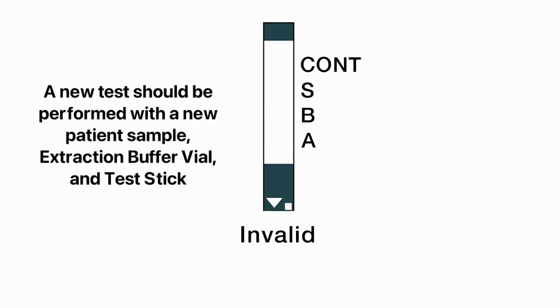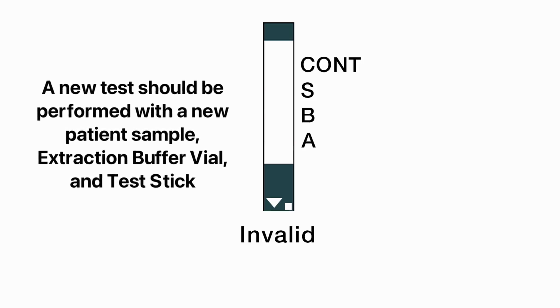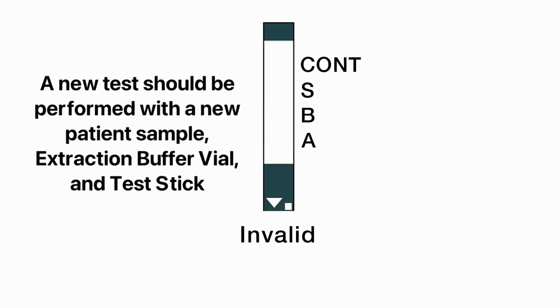Invalid test result. Check to see if a line is visible at the control line CONT. If a control line is not visible at CONT after 10 minutes, even if any other line is visible in the results window, the test has failed and is considered invalid. If the test is invalid, a new test should be performed with a new patient sample, extraction buffer vial, and test stick.